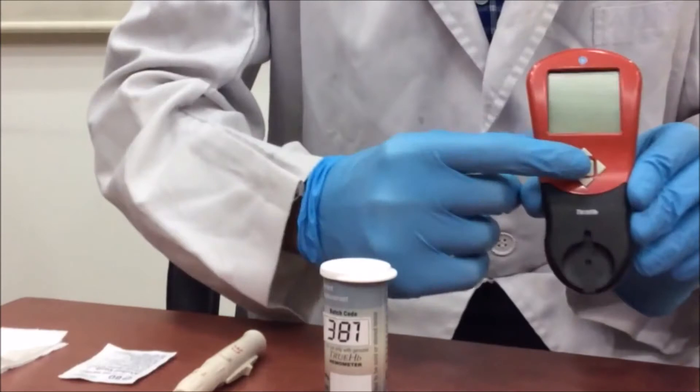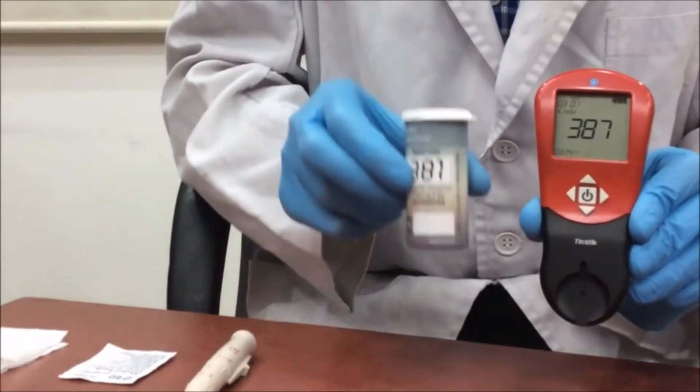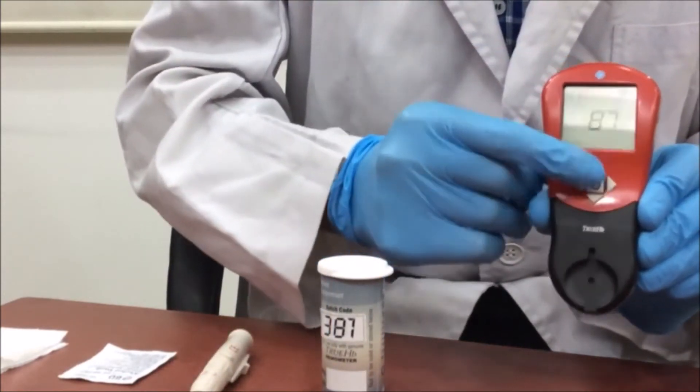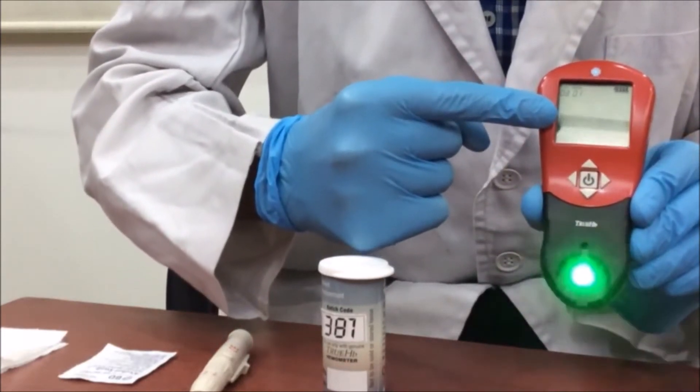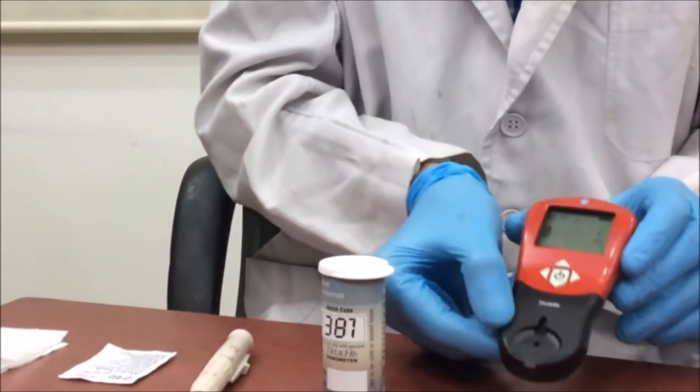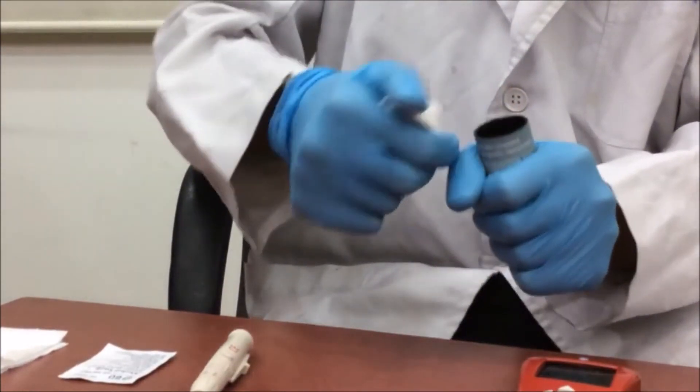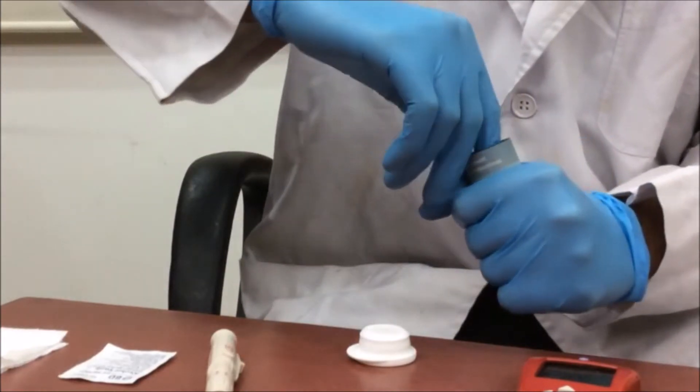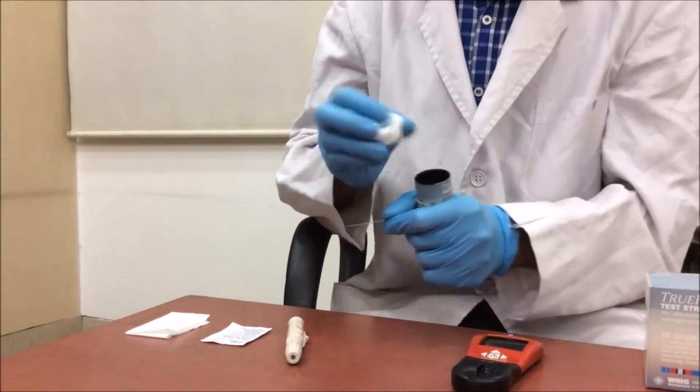With a long press, switch on the device and set the batch code. Refresh the power button. Now it will demand for the test strip. Gently take out a strip from the bottle, then put the cap on the bottle to protect it from humidity.